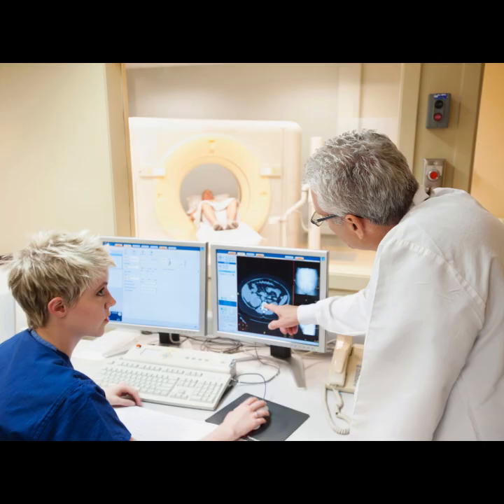And furthermore, these trajectories aren't just globally fixed, they are context-aware. There are studies showing that a trajectory optimized for, let's say, the centralized k-space features of a brain scan looks fundamentally different from one optimized for the more scattered k-space features you might see in a knee scan. This, to me, proves the dynamic method characterizes the inherent image features better than any rigid, globally fixed pattern could ever hope to. Context awareness is interesting, I'll give you that, but standardization is absolutely vital in medicine.